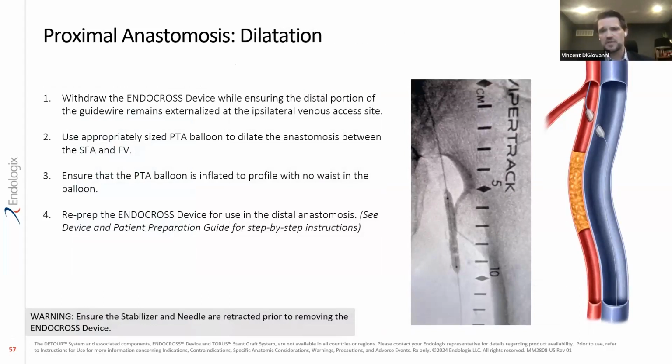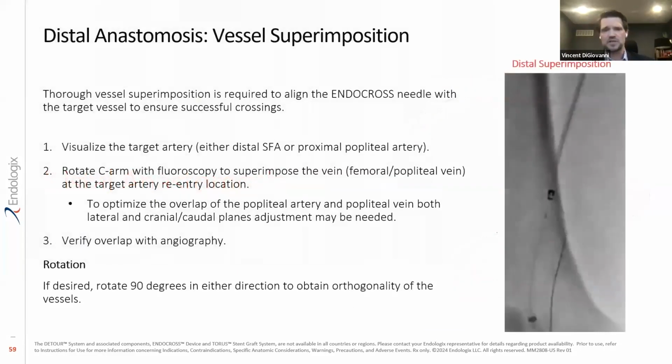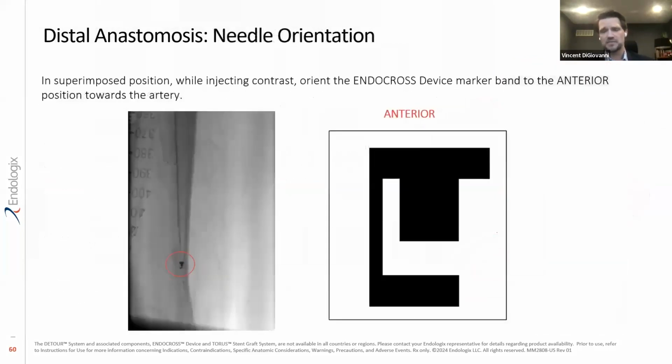This is a cartoon picture, as Pete's shown. This is just showing it a little bit better, moving the anastomosis from the arterial to the venous. And again, it's not so paramount that at that proximal anastomosis you're very aggressive, although I would still encourage you to do that. But the distal anastomosis, it's absolutely paramount that you really balloon the heck out of that as much as you're possibly able, because that's when you're going to lose your floss wire and you're going to lose a lot of pushability. You're also pushing through a lot more leg at that point than you are in the proximal anastomosis, and you're a lot further from your 8 French sheath.